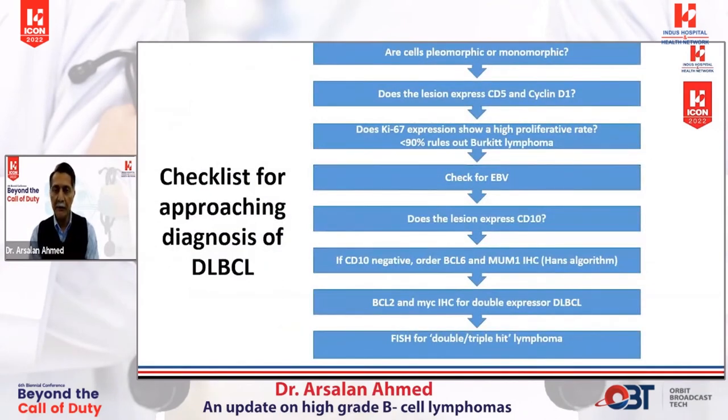So how do I approach it? First thing, are the cells pleomorphic or monomorphic? If it's pleomorphic, it's easy. Diffuse large B-cell lymphomas are pleomorphic. If they are monomorphic, then I have to think about whether it is blastoid looking. Can it be mantle cell lymphoma? Could it be ALL itself?